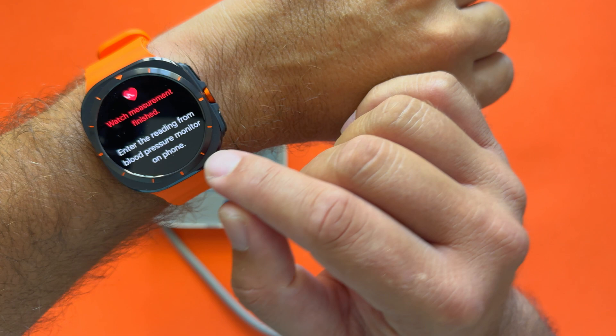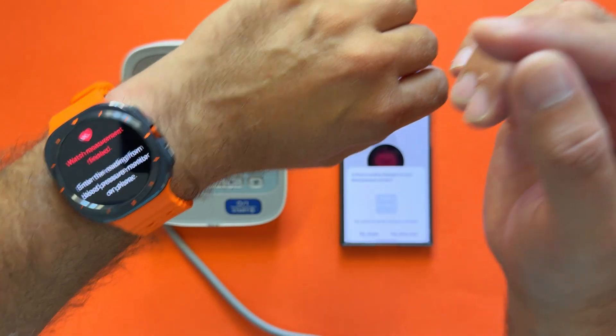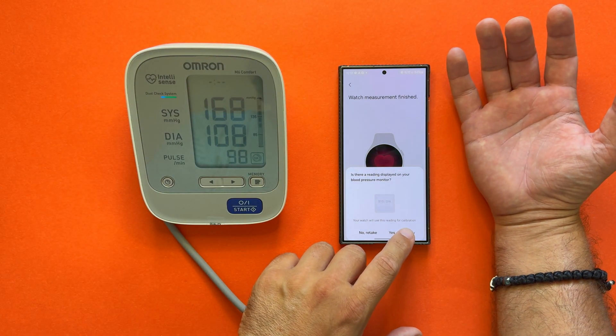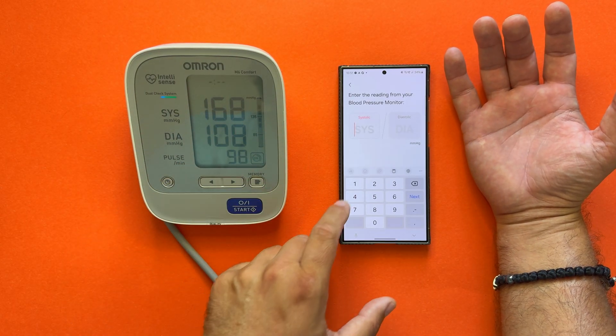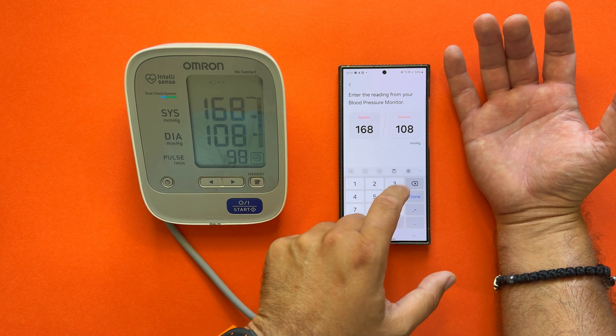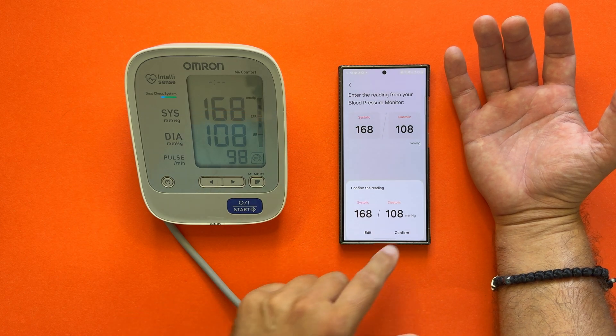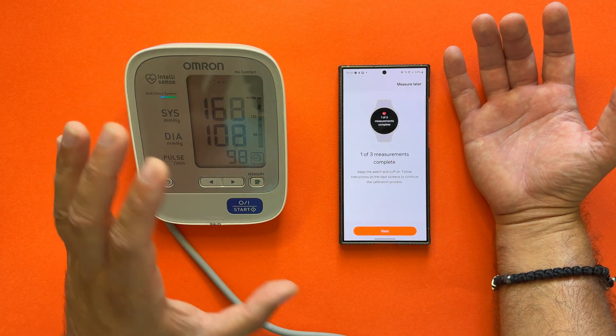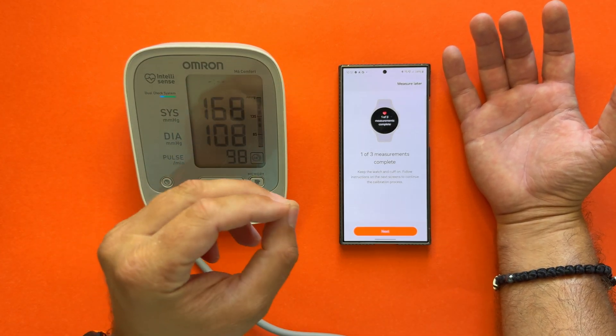Now what is important: enter the readings from the blood pressure monitor on the phone. I will enter it right now—I have 168 for the systolic and 108 for the diastolic. I'm going to press Done, confirm. Now we need to complete two more measurements. Let's do this.